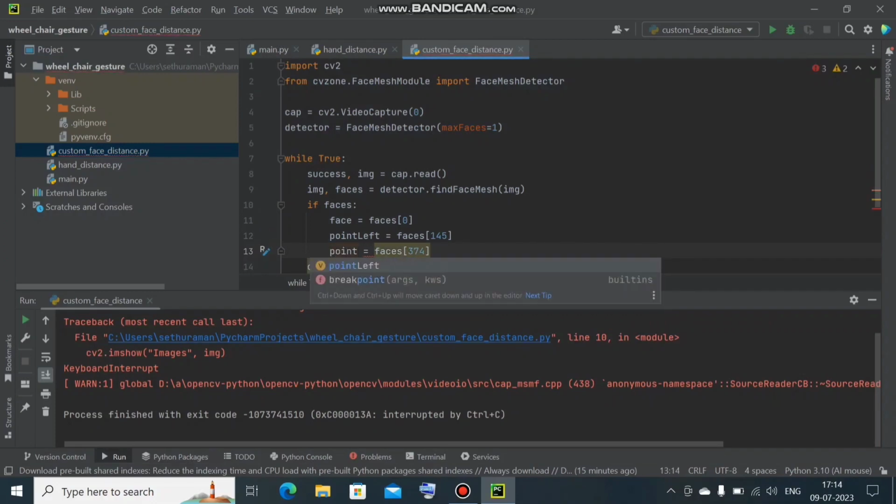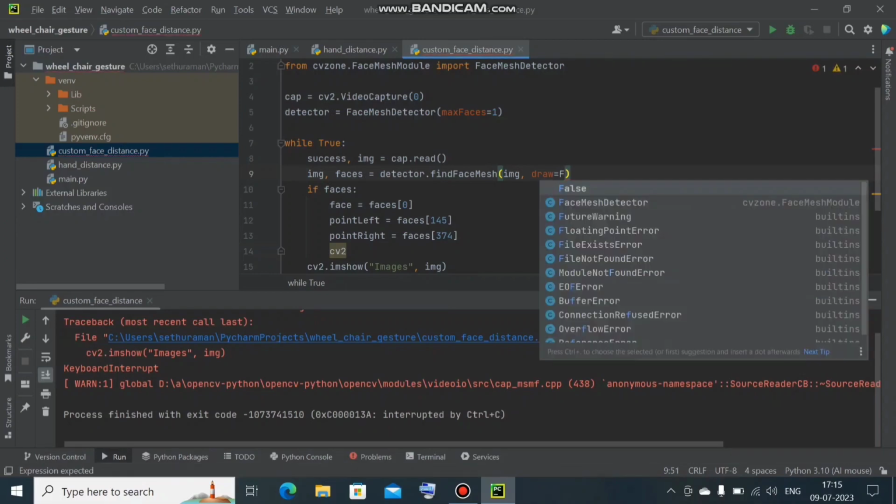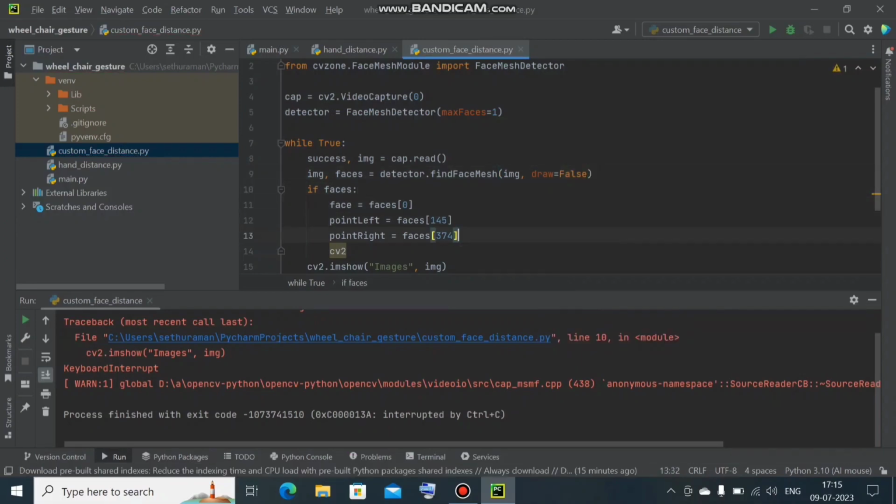Oh, point right. So next, we will draw a circle. We can mention draw as false, or else it will be annoying. If I make draw false, then the white color dots you see on my face won't come again. So only the points I have mentioned here, point left and point right, I'm now going to make visible by drawing a circle.